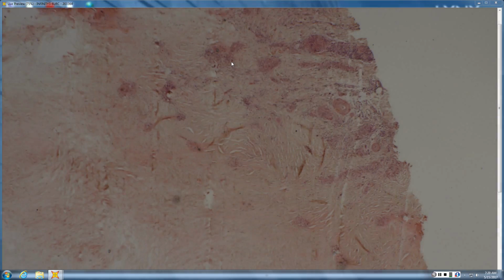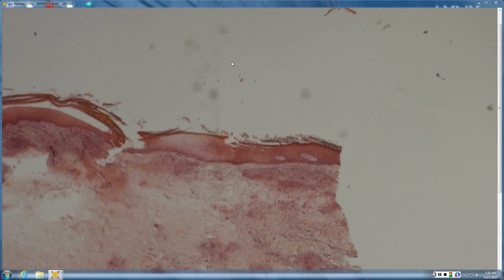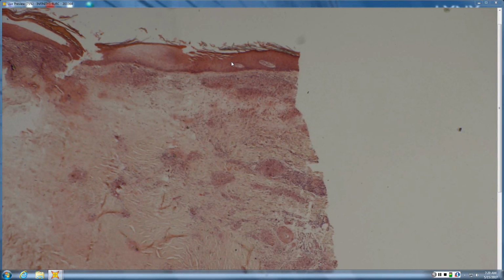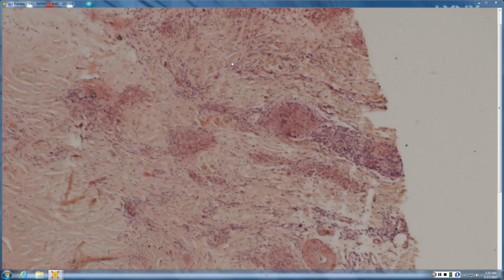Okay, so 13. This one is a silica granuloma, and it's not the best ever cut of it. It's just sort of this area here off to the side. But you remember there's a lot of different things that can give you different granulomatous responses, sarcoidal granulomas and other things. So this is kind of in the sarcoidal granuloma differential, as well as like borreliosis and some other things.